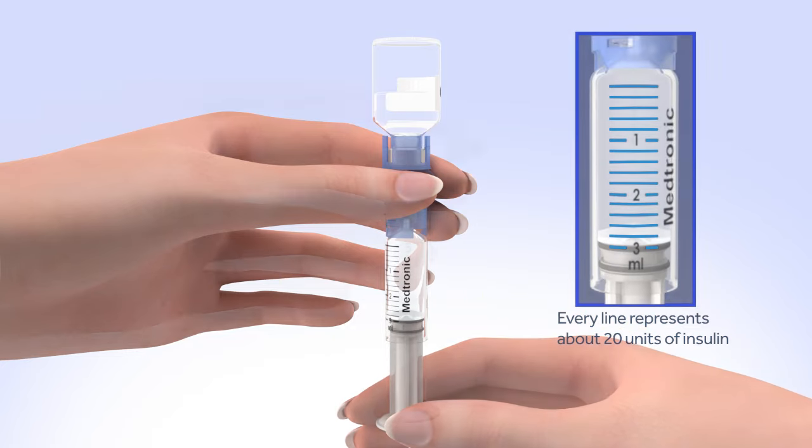Unscrew the plunger rod counterclockwise until it completely separates from the reservoir. Put the reservoir in the pump and turn the tubing connector clockwise until you feel the reservoir lock into place. The tubing connector should line up with the groove in the battery cap of your pump. Now you will need to load the reservoir in the pump. Since you did not change the infusion set, the cannula does not need to be filled. Follow the steps on the quick reference guide for how to complete changing the reservoir. Hold the cannula housing steady with your finger, then push the site connector straight into the cannula housing until you hear a click.